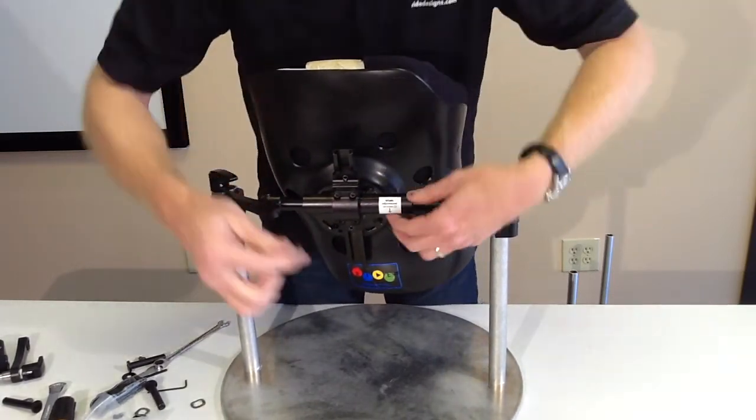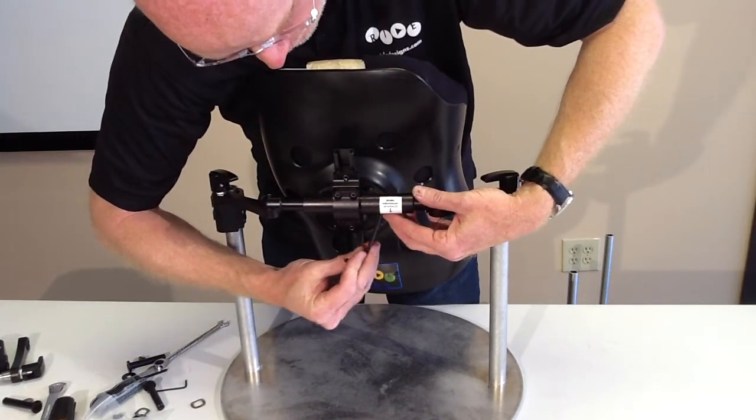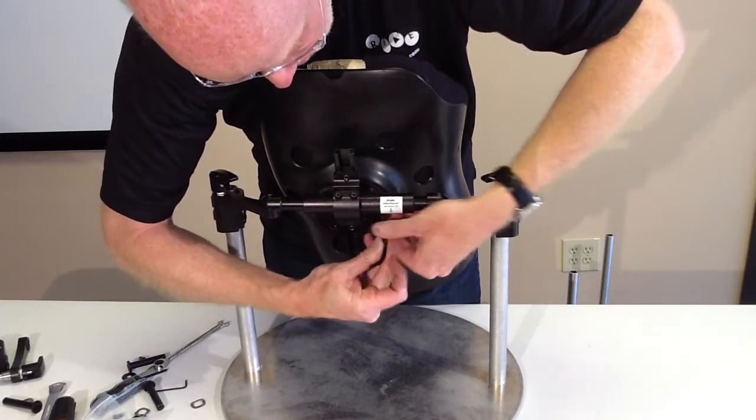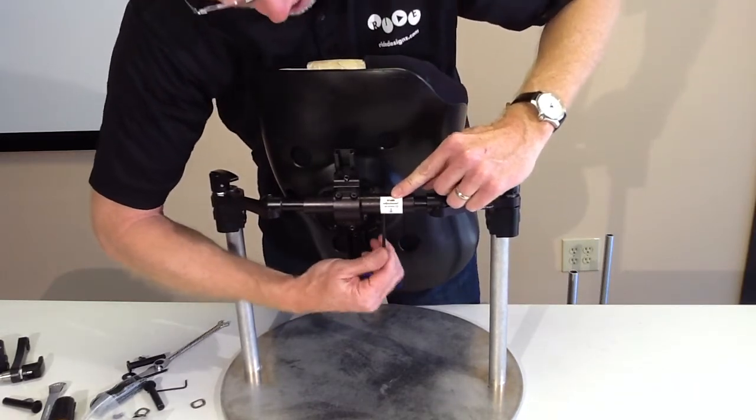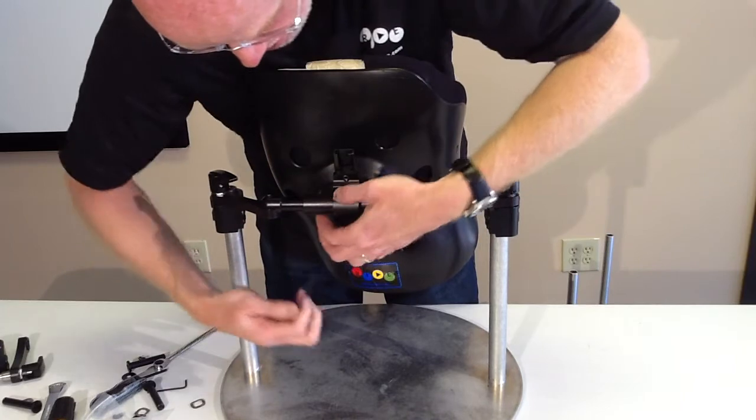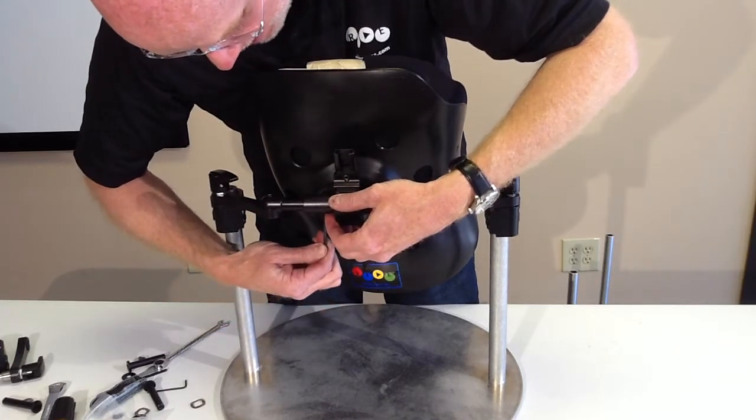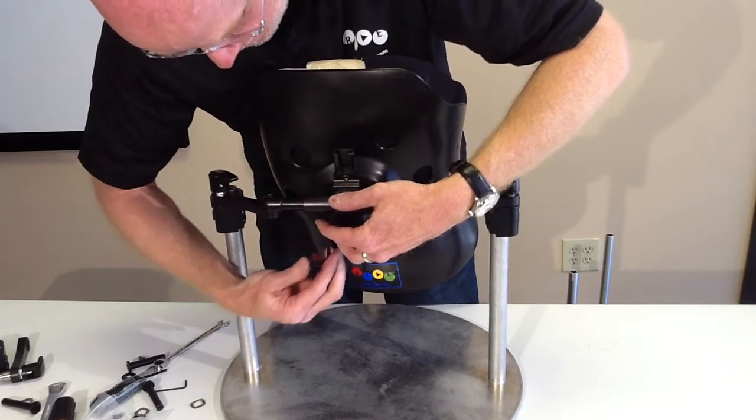Now I will go to my width adjustment screws, which you access from below. These are easy to forget. That's why we put this sticker here. Width adjustment screws, set screws. Those need to be tightened down, otherwise the back will move laterally.